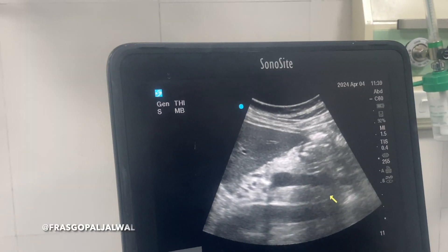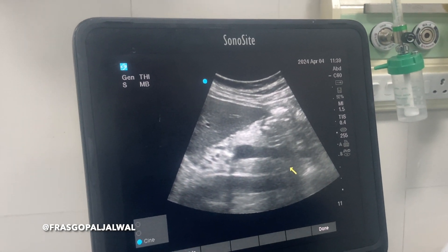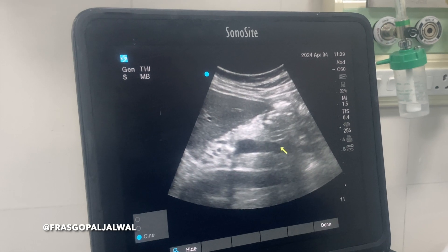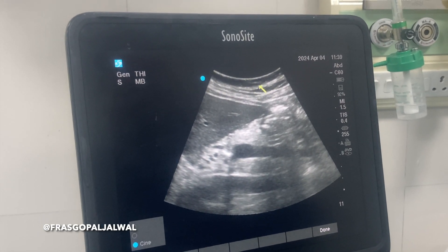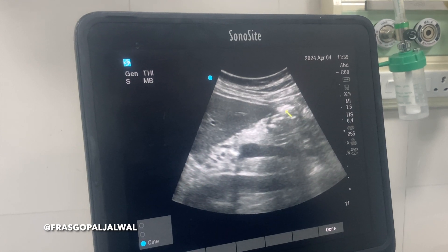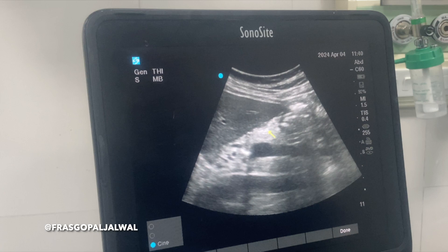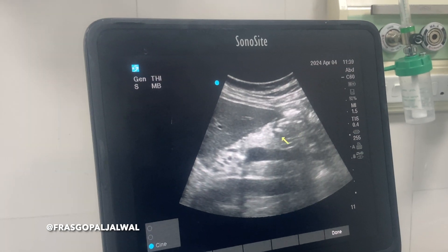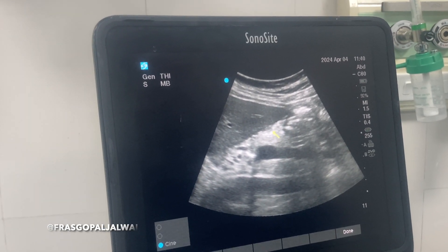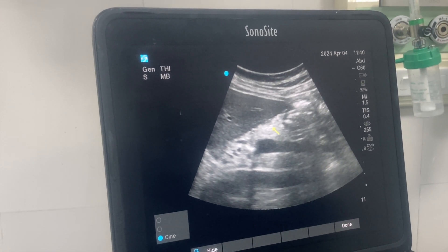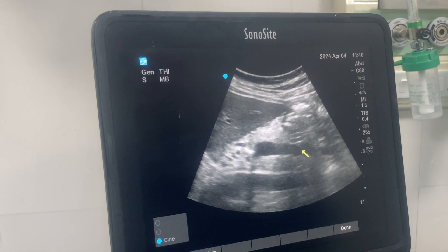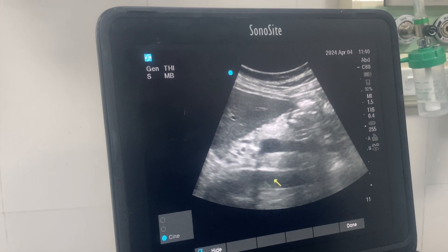This is the sonoanatomy of the same patient in the right lateral decubitus position. Here you can see these are the rectus muscles, this is the liver, and this is the antrum. The antrum size appears larger than in the supine position because food contents gravitate toward the antrum in the right lateral decubitus position. Just below the antrum you can see a hyperechoic structure that is the pancreas, and this is the superior mesenteric artery.